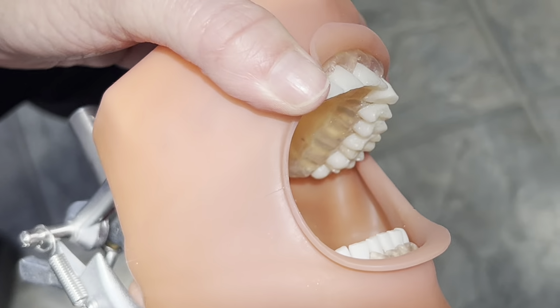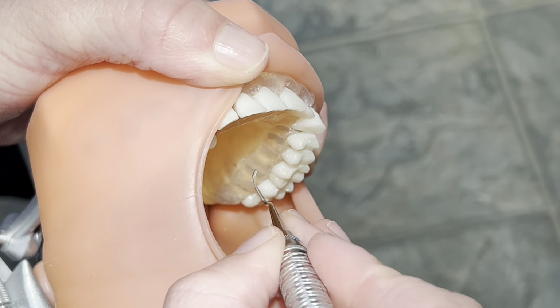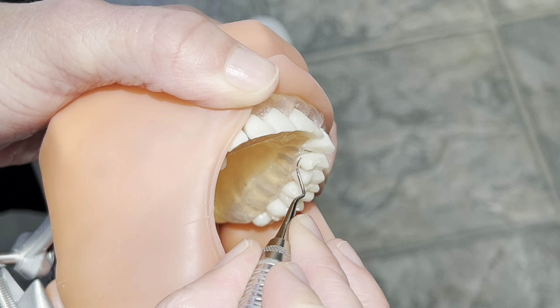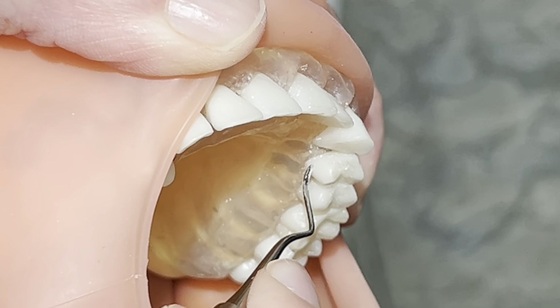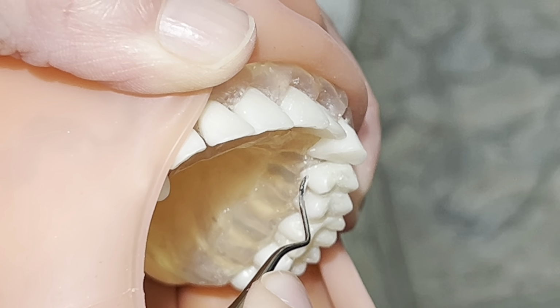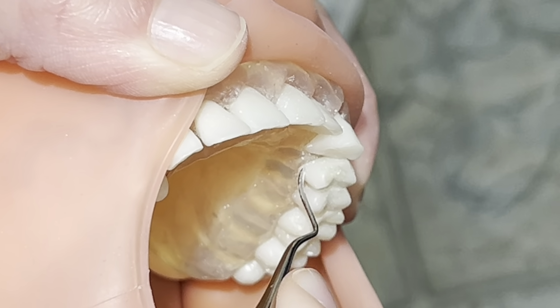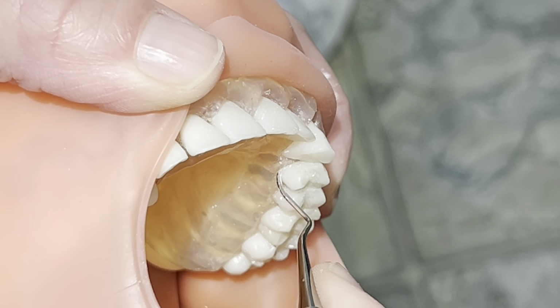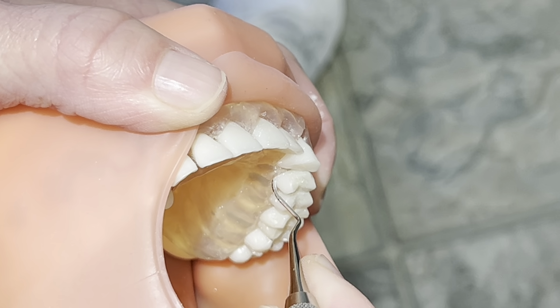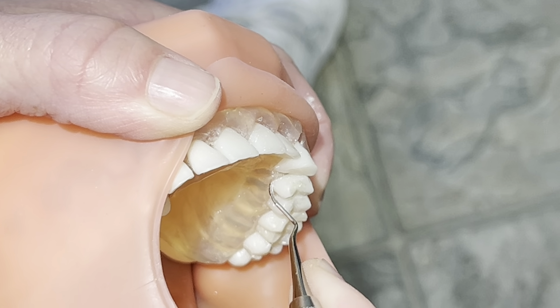Last, the lingual surface. On the lingual, just looking at the angle of the instrument. So 90 degrees is about here. The blade is open. The heel is away from the tooth. When we close that angle to 70 to 80, the heel gets closer to the tooth. The blade closes in on the tooth as well.